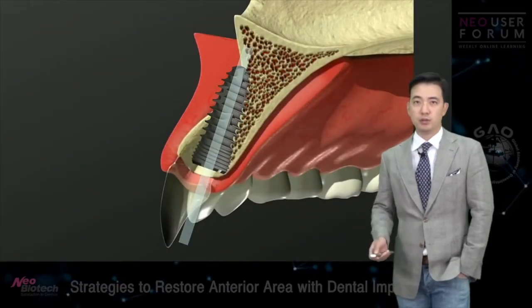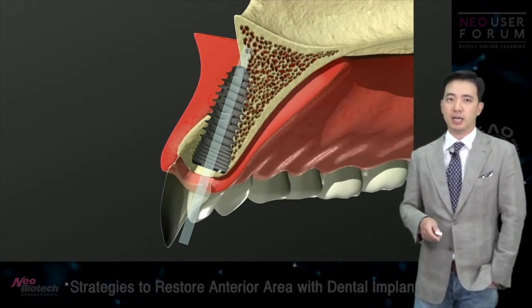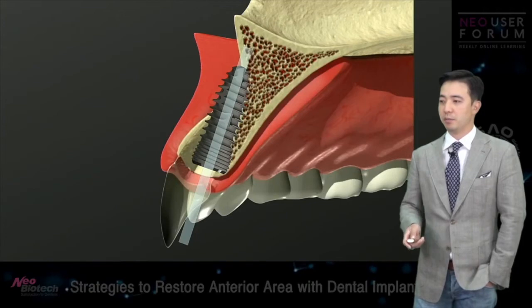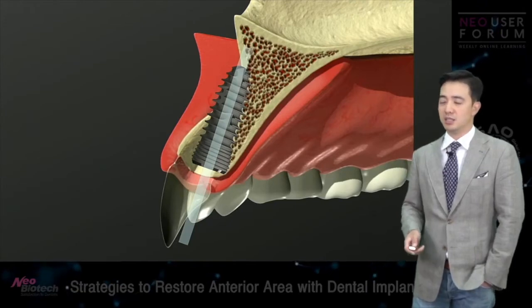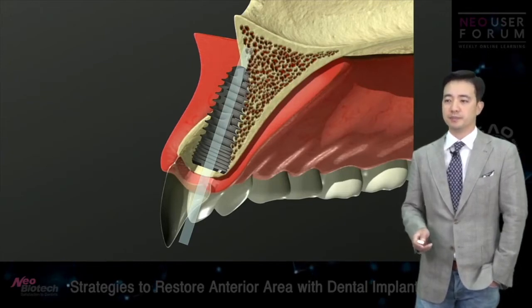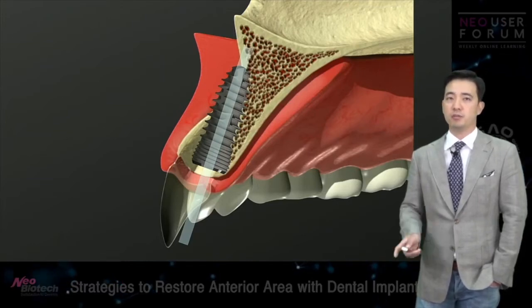What I want to do personally is I would still go for this kind of position, because your implant is going to last in your patient's mouth for decades, and just because it's easier to place your implant according to where the patient's bone is doesn't mean that whatever prosthesis you put in the patient's mouth is favorable for the patient.